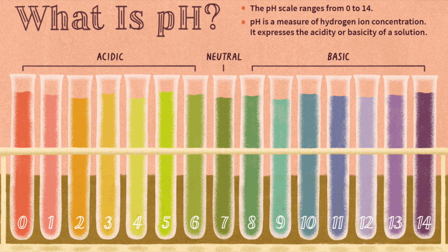So we want a pretty even level of acid and base to give us this feng shui, even, neutral ground. So on this scale, you'll see a 7 is considered neutral just by whole numbers. Like I said before, for our bodies, 7.35 to 7.45. Our middle ground would be a 7.40.